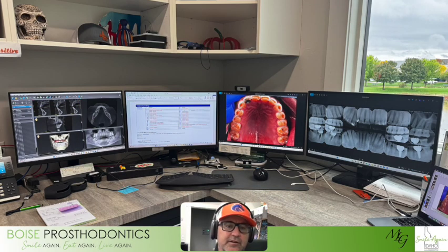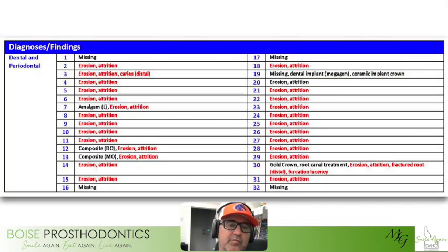Then, again, here's my current setup of how we do that. You'll notice on that second from the left screen, there's a table or chart that I'm going to go through here. I show that because when I'm going through that table, I'll have up all the x-rays, all the images, tooth charting, and even trying to have the CBCT up, because I'll make a detailed list of every diagnosis on every tooth.